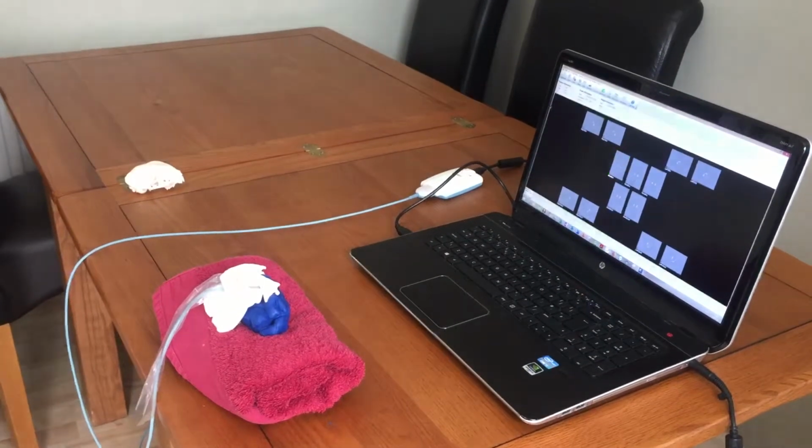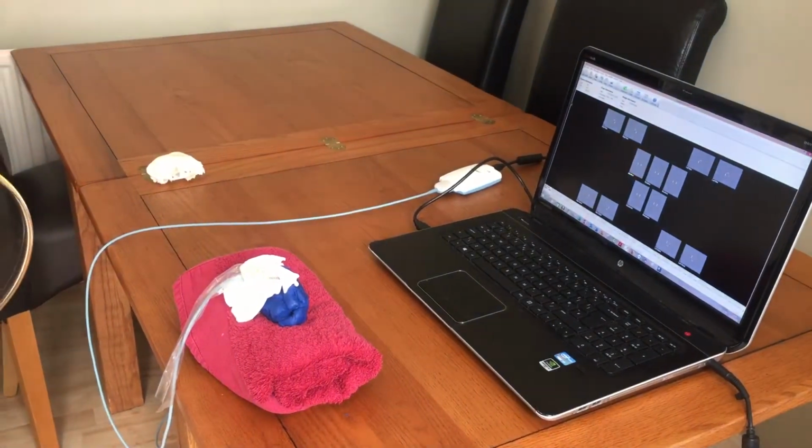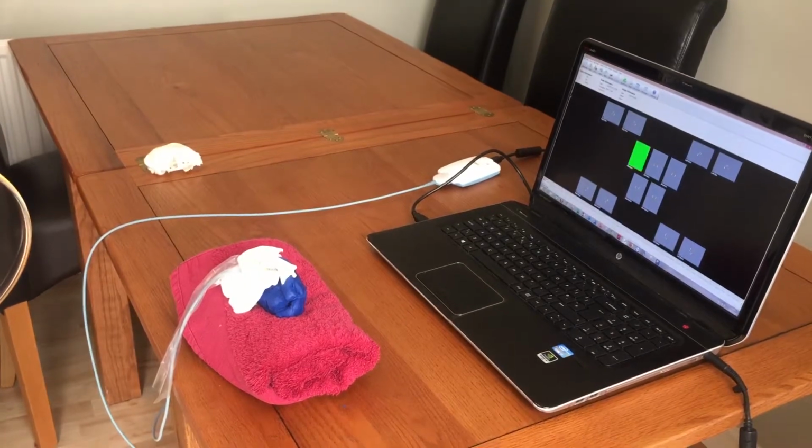This is Rain Leary from Clark Dental. We're just going to cover how to take mandibular dental radiographs on a cat.